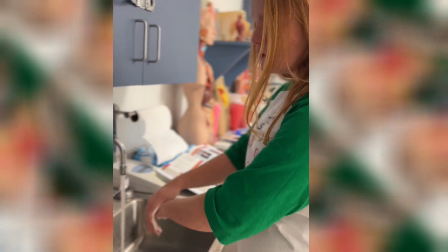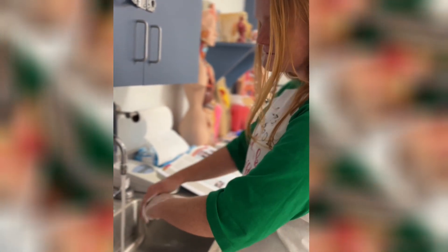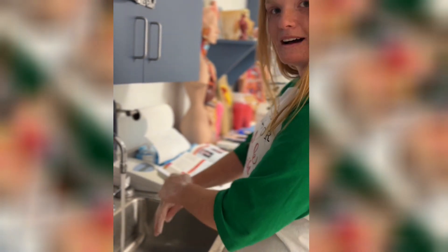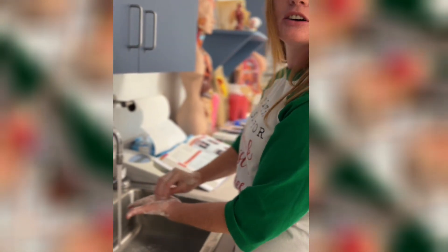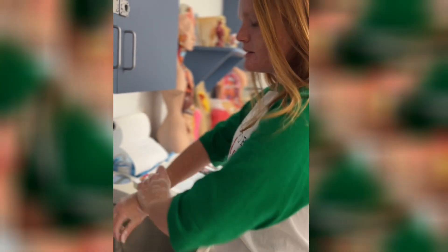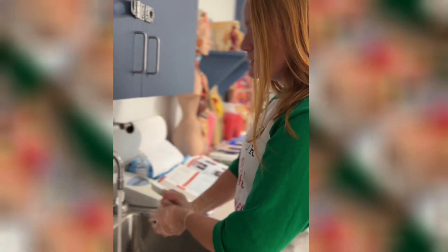Scrub the back of your hands for five seconds — one, two, three, four, five. Then do your fingernails, because you always want to get all the dirt out from under them — five seconds each. Then come up and get your wrists, because you want your wrists to be clean too. Then rinse, keeping your hands pointed down.